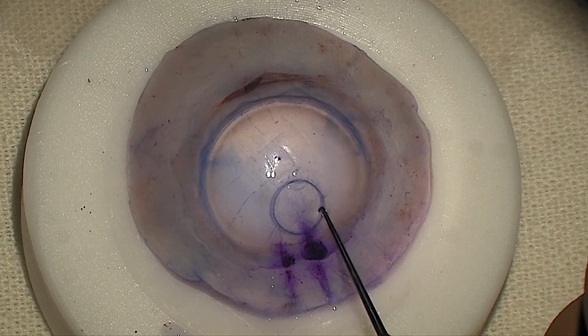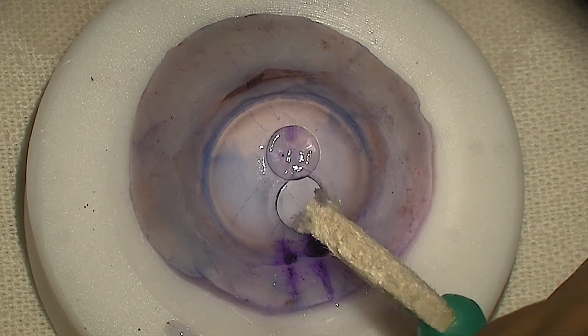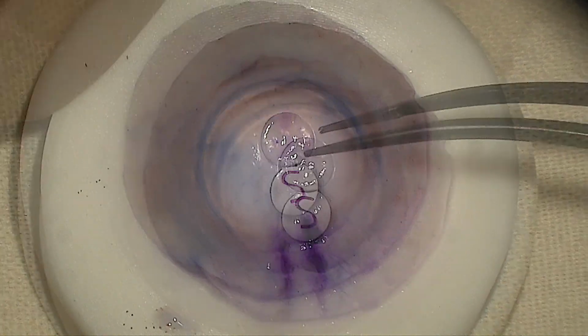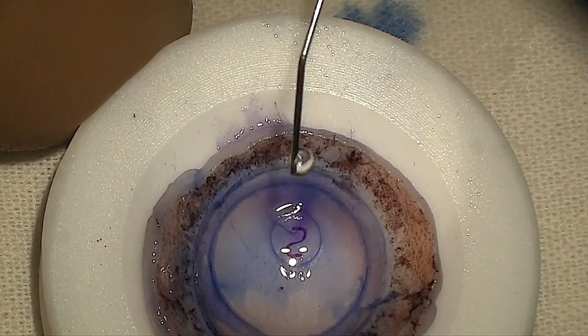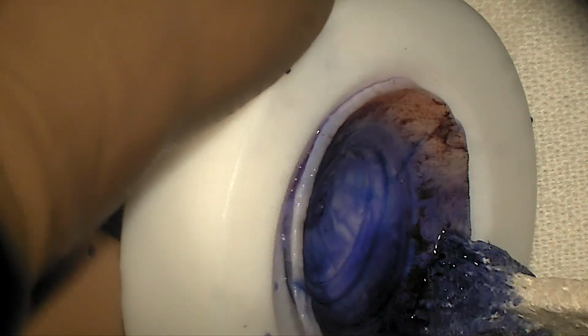The corneoscleral button is then flipped, and a stamp is put on the DM side after drying through the trephinated window. The cap is replaced and the tissue is flipped again with the endothelial side up. Now, an 8 mm trephination is done with superior eccentricity with extreme care so as to harvest most peripheral donor tissue.